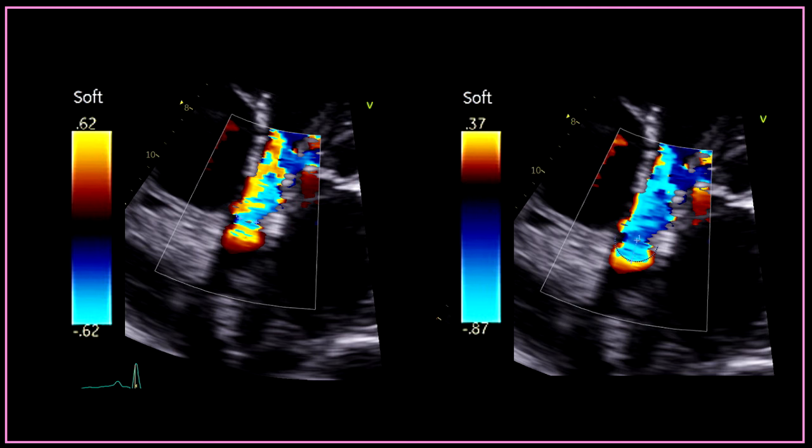And thanks to this, you can clearly visualize the hemisphere line and you are ready to measure your PISA. So it all depends on the direction of the regurgitation. If the regurgitant flow goes up, just shift the baseline up. If the regurgitation flow goes down, just shift the baseline down.